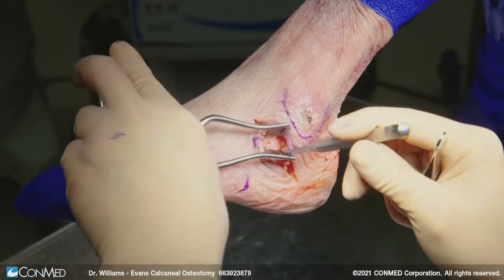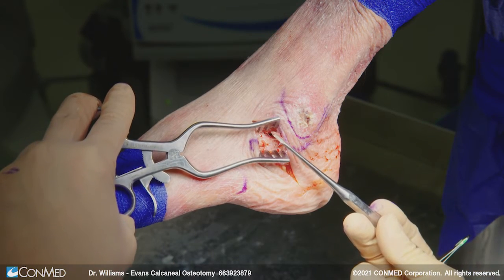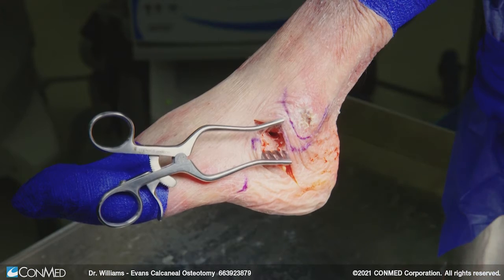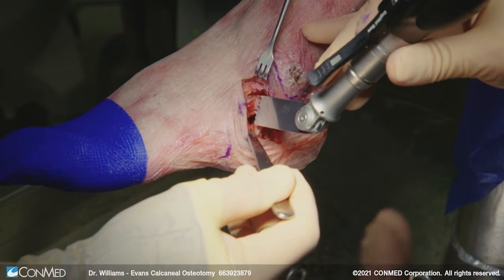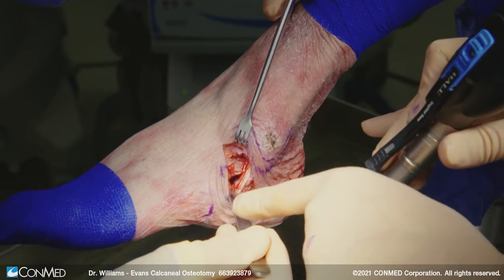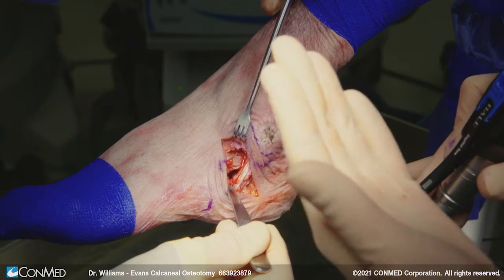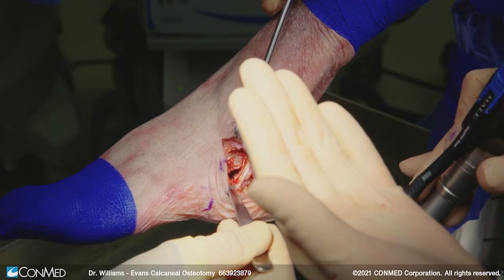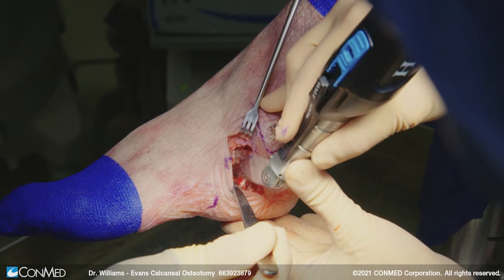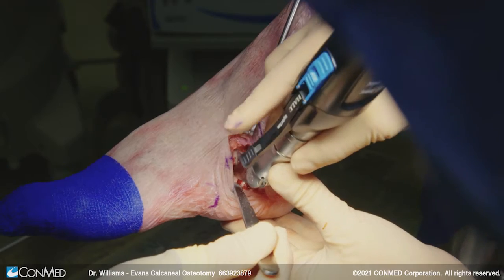Now I've come underneath my calcaneus, keeping in mind that the calcaneus comes at an inclination angle and it narrows down, so you can quite easily get over the top of those peroneal tendons. We're going to aim for about a centimeter and a half proximal to the calcaneal cuboid joint. Have an assistant take a Hohmann retractor down below. You want to avoid a lot of plantar dissection through this area because you've got the long plantar ligament. Now we simply take a cut going from medial to lateral, perpendicular with the bone, and then finish it off with an osteotome.